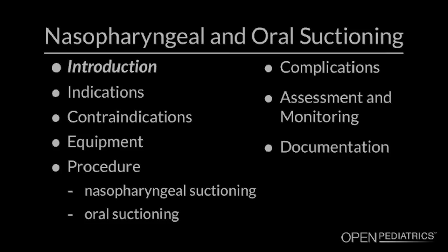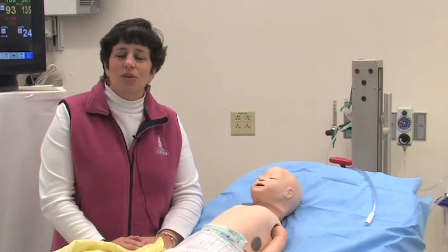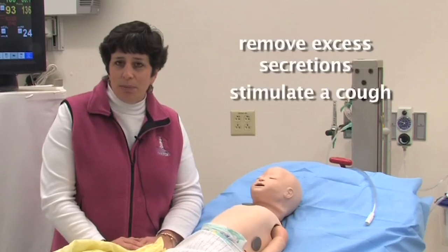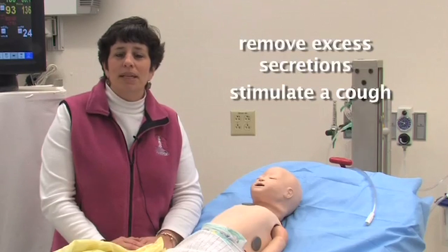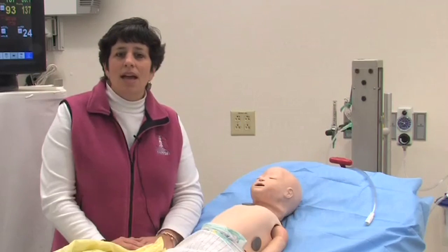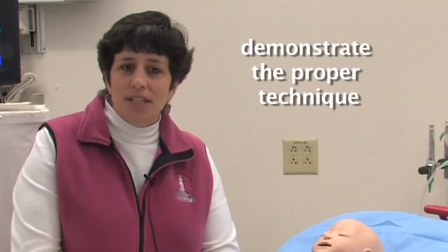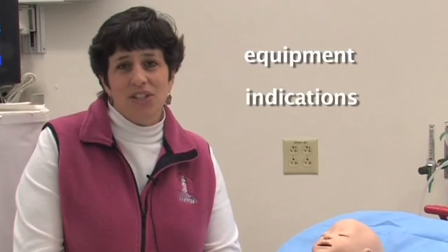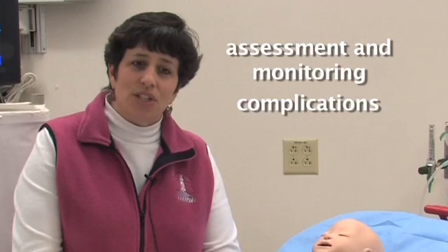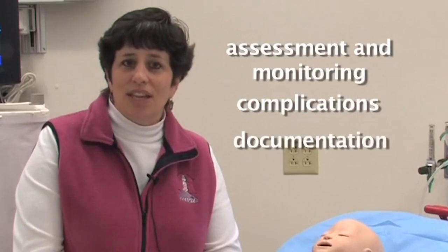Nasopharyngeal and oral suction may be completed on a patient to remove excess secretions or to stimulate a cough in a patient who doesn't have a good cough, to help maintain a patent airway as well as promote oxygenation and ventilation. In this segment I'm going to demonstrate the proper technique used at Children's Hospital Boston for both nasopharyngeal and oral suction. I will review the equipment needed, indications, contraindications, patient assessment and monitoring, potential complications, and documentation.